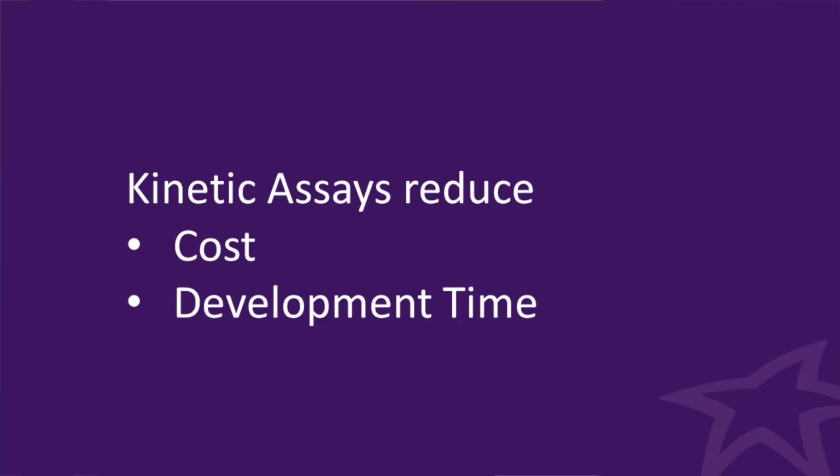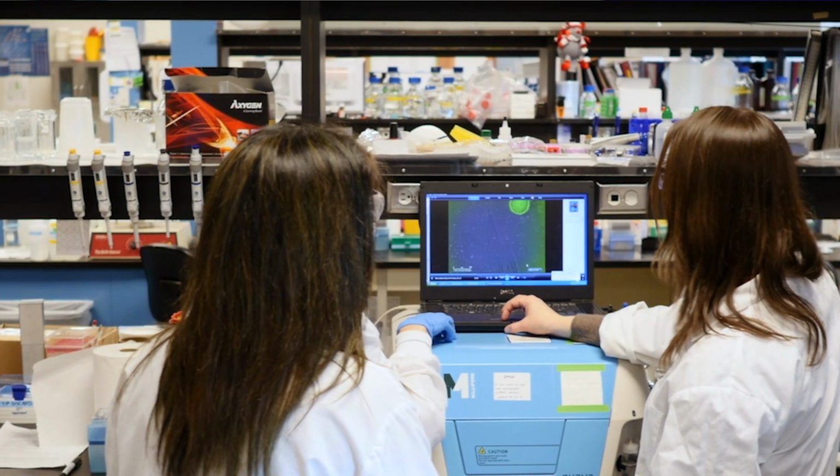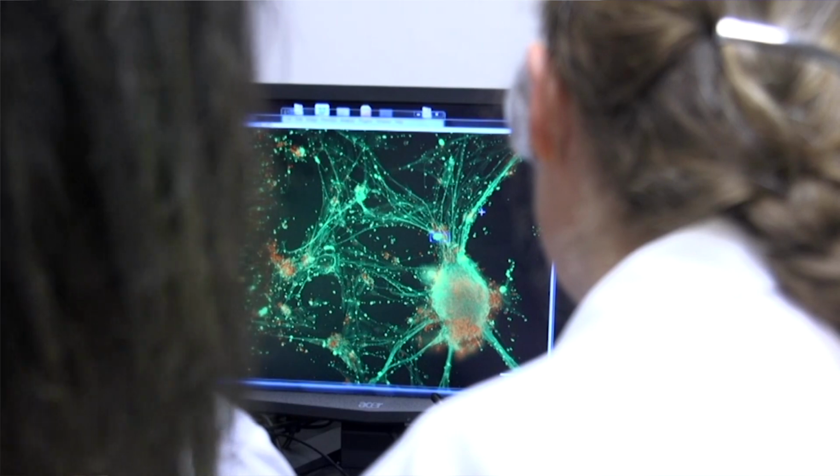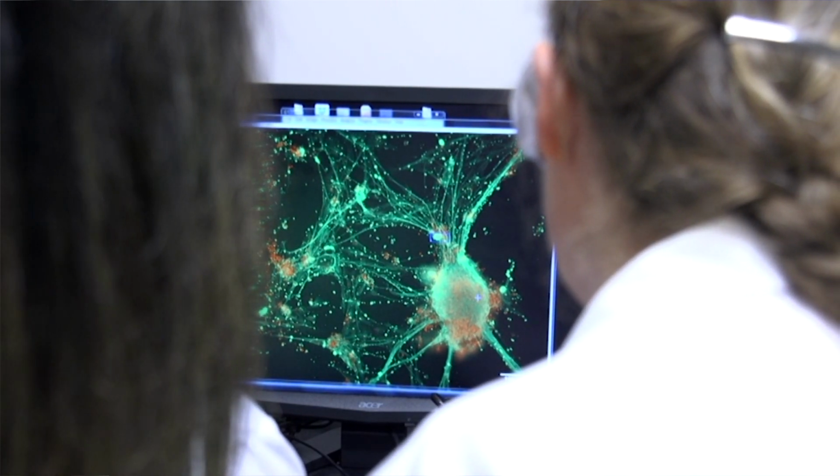The reason why I like kinetic assays is several-fold. Number one is cost reduction, both on the ultimate device and on the time to development side. And I'll tell you about that. So on the device side, often we'll look at fluorescent-based systems. And if you're looking at it, particularly if you're doing a microbiology system, sometimes those systems are disposable, right? Throwing away the thing at the end of the day. And so if you're throwing away a really expensive photospectrometer, that's not very good for the bottom line. And so you'll want a system that's very inexpensive, and a good way of getting around that is a kinetic-based system. It's just looking at an increase in signal over a noise floor, so that's really handy.